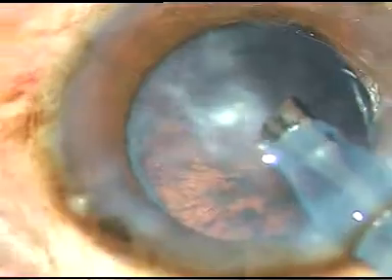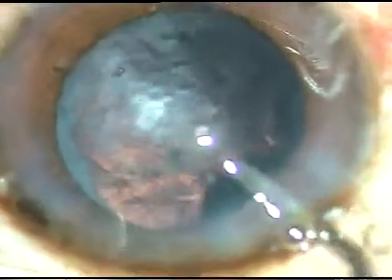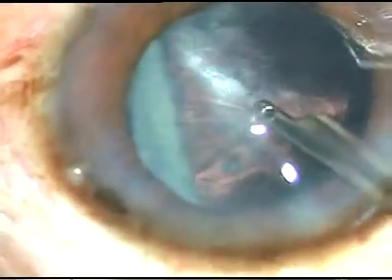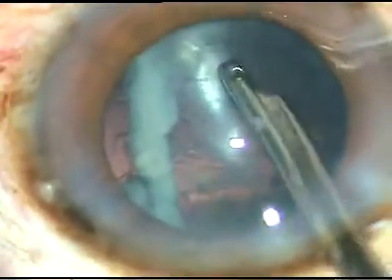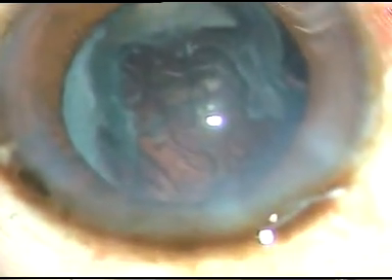Now I can see that the epinucleus is very thin, and if I try to remove this thin epinucleus with the tip of the phaco-handpiece, I may cause a PC rent. So I use my direct Simcoe cannula. I pull this epinucleus towards the center as much as possible, and now I inject some OVD.